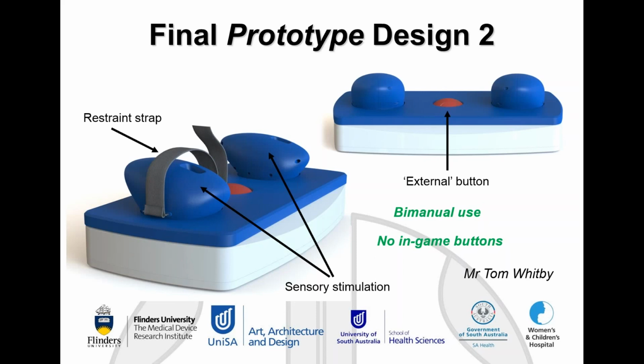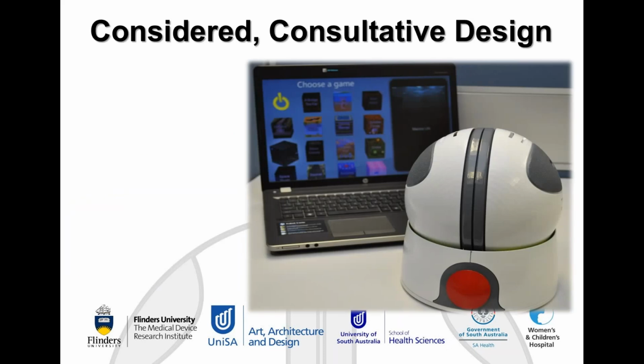We put both of these controllers through a focus group with teenagers with cerebral palsy, and it was really quite an amazing and enlightening experience to see these two teenagers use and interact and make comment on the controllers. And in the end, the controller we went with was this one here. The reason we did this was because this controller ended up being more intuitive to use for the player. So they instantly would sit in front of it, they'd put their hands on the controller, and in doing so they had an instant appeal, but also an instant connection to using the controller in the way we wanted them to use it when they played the games.